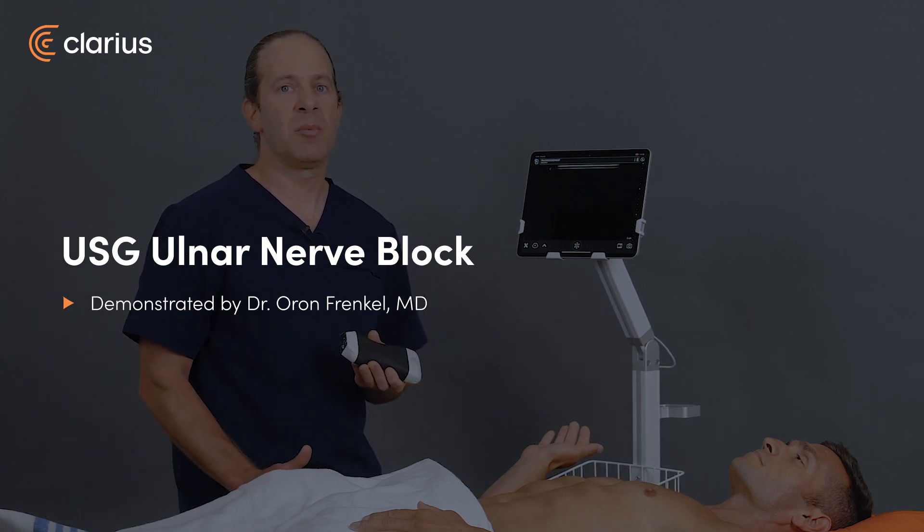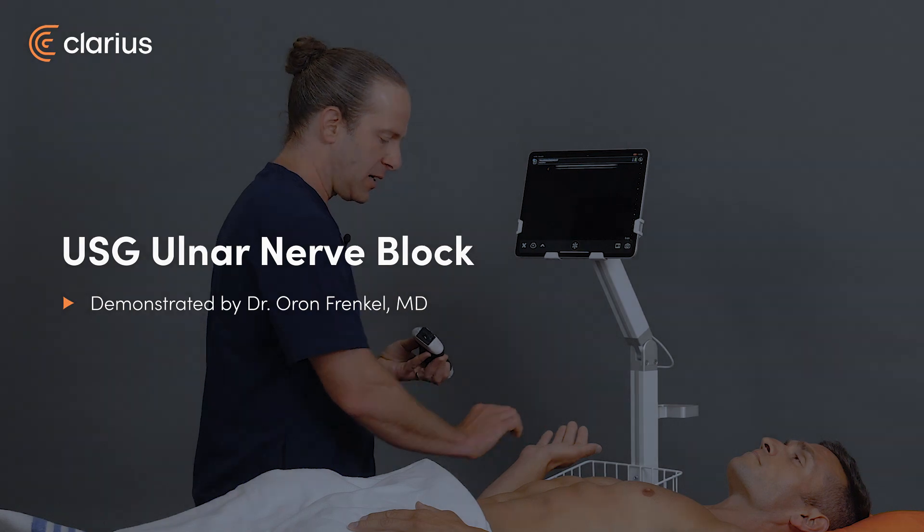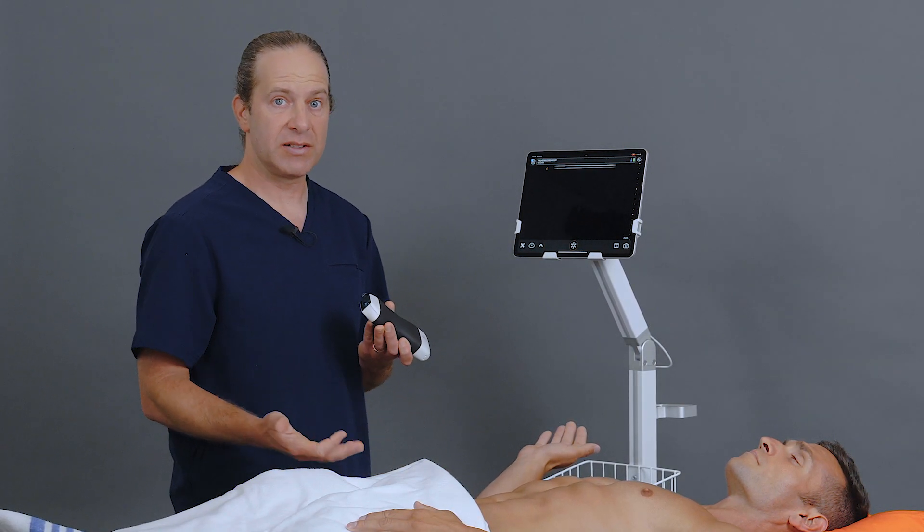An ultrasound-guided ulnar nerve block can provide excellent anesthesia to the ulnar aspect of the hand and distal forearm, either for its own sake for pain control or to facilitate other procedures.